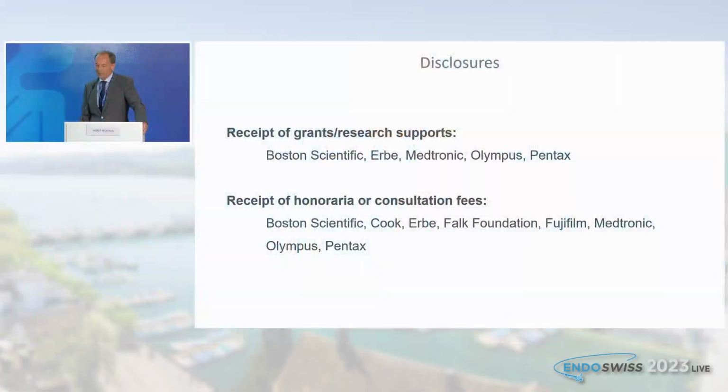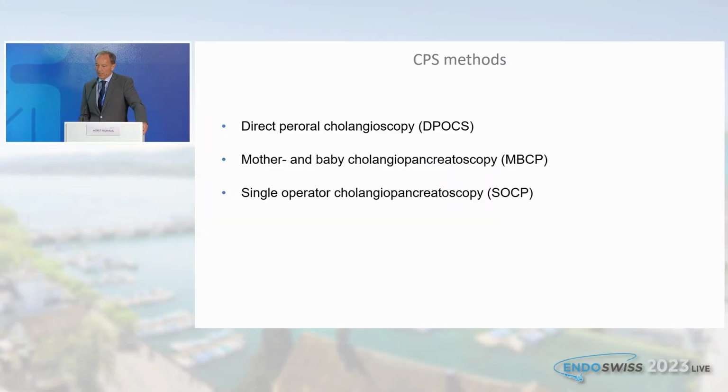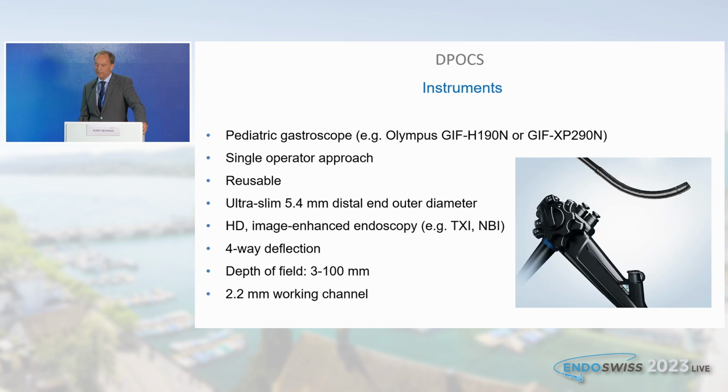I would like to talk on CPS, cholangiopancreatoscopy. These are my disclosures. So we have three different methods for CPS: direct peroral cholangioscopy, or DPOCS, mother and baby cholangiopancreatoscopy, MBCP, and single operator cholangioscopy, or cholangiopancreatoscopy. The term single operator is a little bit misleading because DPOCS is also a single operator technique.